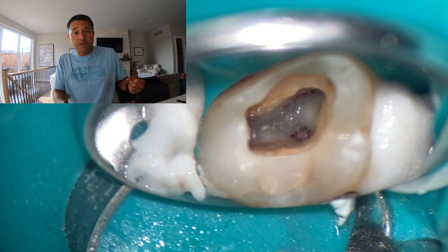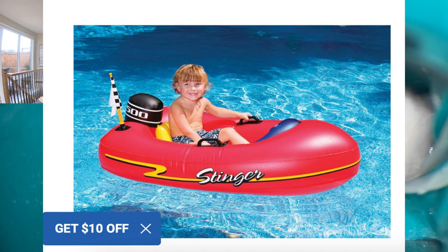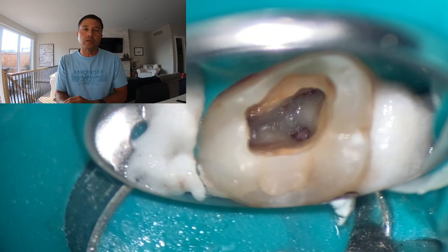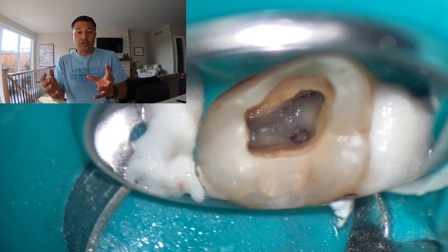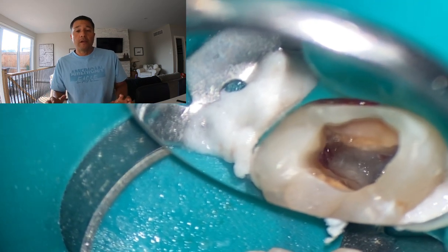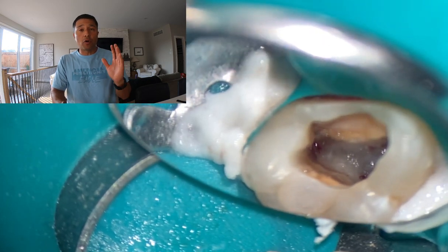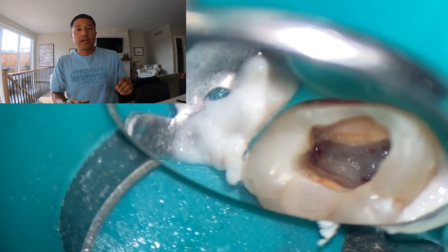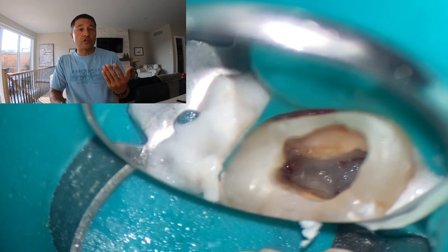With a lot of experience — but that's why I'm putting this video on here. If you're in the same boat and you have an open pulp chamber, that endo Z bur can save so much time. Here's our distal buccal orifice. If you're planning on doing a stage 2, which is happening here, you could actually leave this — there are a couple of great articles, I'll put them in the comments below. This has been going on for years: you could leave this as a pulpotomy. The patient's acute symptoms will be removed 99% of the time, and then you can bring the patient back and finish stage 2.